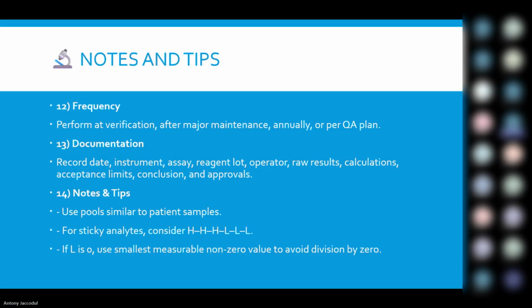Notes and tips. You can use pooled samples similar to patient samples. You can use commercially available samples. And for sticky analytes, consider the order of high, high, high, and then low, low, low.